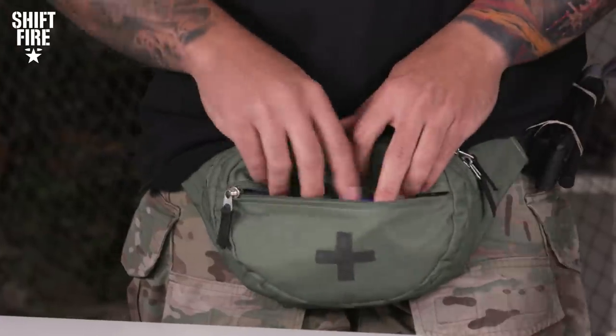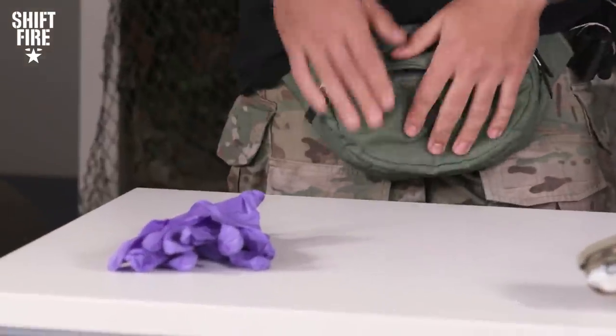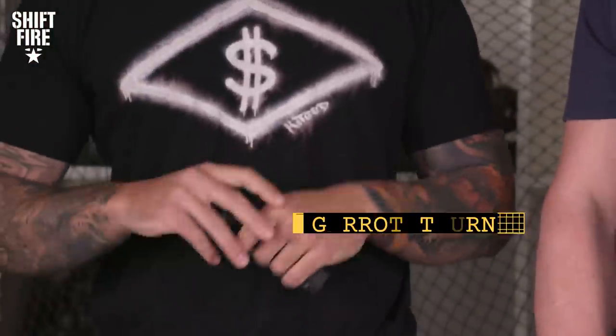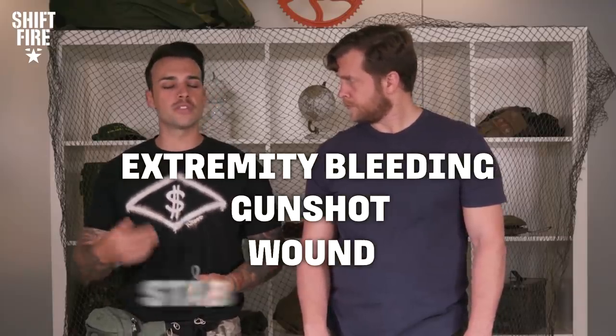First and foremost, something every IFAK should have is PPE gear — gloves. A lot of times people overlook it because they think they won't have time, but in the civilian world you don't know what they have and they don't know what you have. You want to be as safe as possible. It's not an offense to them — it's to keep them from getting what you have. This tourniquet is what's going to prevent the biggest killer on the battlefield, which is massive hemorrhaging. Bleeds to your extremities, gunshot wounds, stabs — this is going to be the first thing you go for. We're just stopping blood loss.